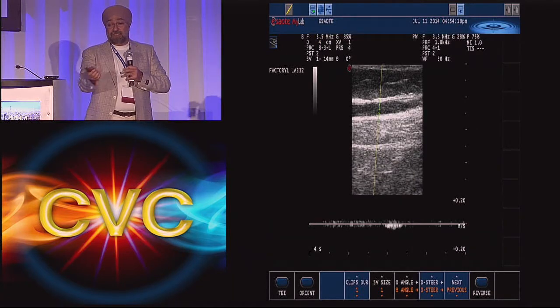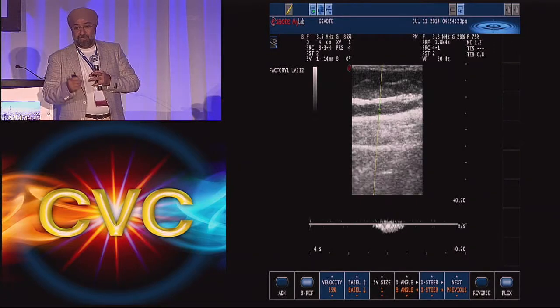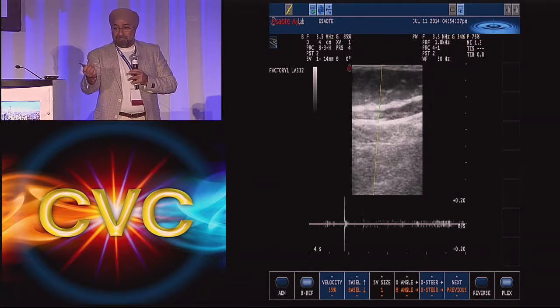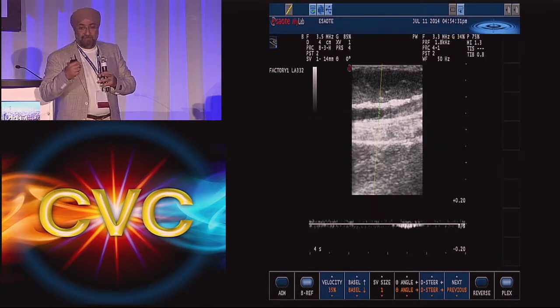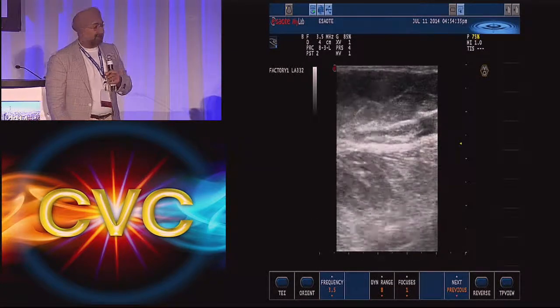So this is how I explain it to the patients, it's all plumbing. I joke with them, I'm a plumber, and then they laugh. And then I tell them I'm soldering this. A lot of them, I show them the fibers, I let them watch the ultrasound screen or play music. So to them, they dissociate this whole thing from pain and anything else.